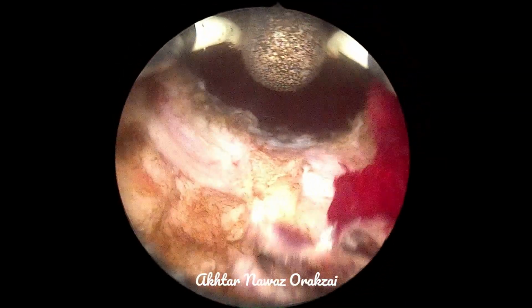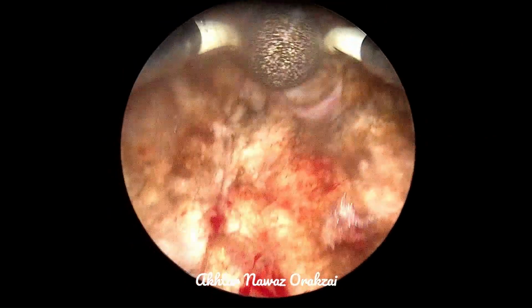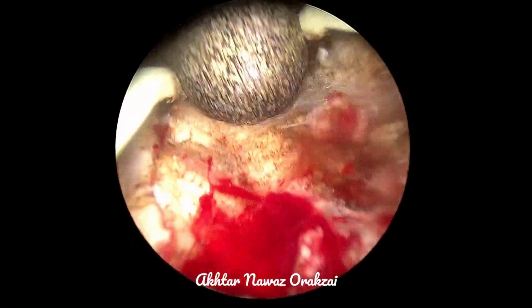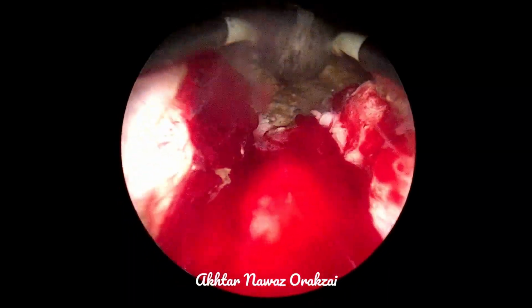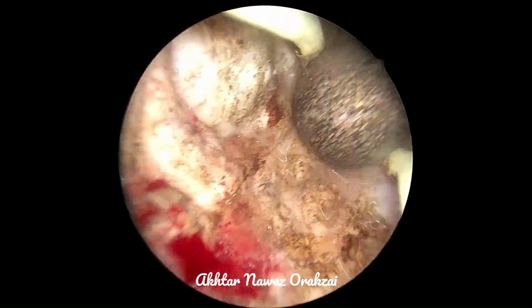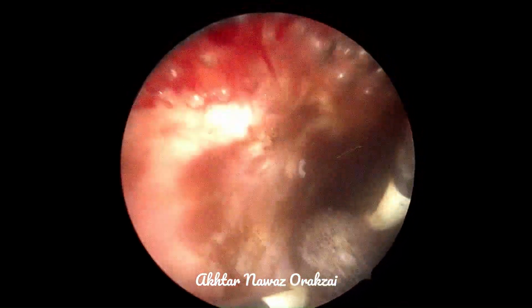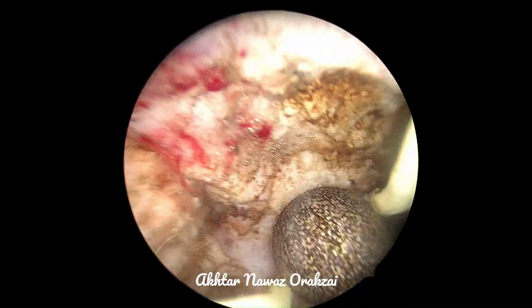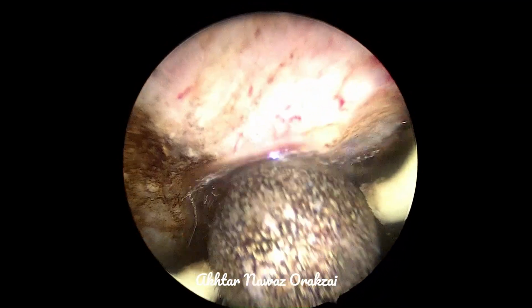Here you can see that small black dots are seen, which show that resection is almost complete for this particular patient. There is no need to coagulate the whole cavity. The more you coagulate, the more charring is produced, and more charring leads to more chances of infection, number one.